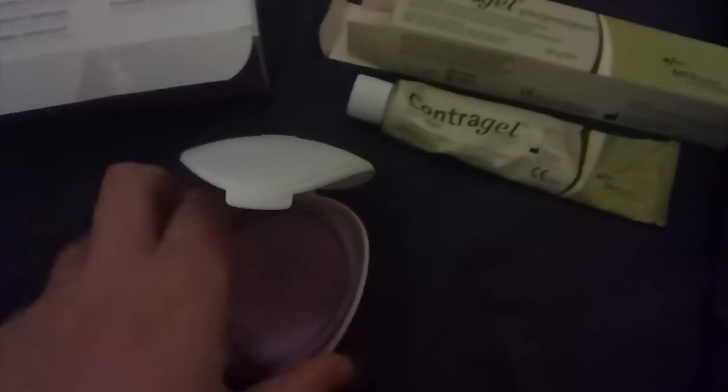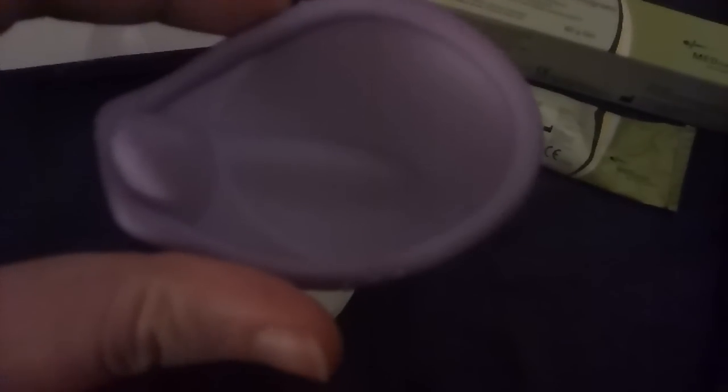It's basically only as deep as your cervix, which is all it needs to be. To use it, you take the diaphragm, put some contraceptive gel inside and a little bit around the edges, then squish it. It has little grip marks — you can just about make them out just under where my thumb is.